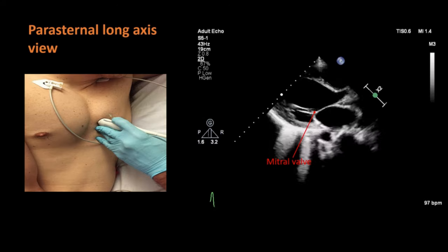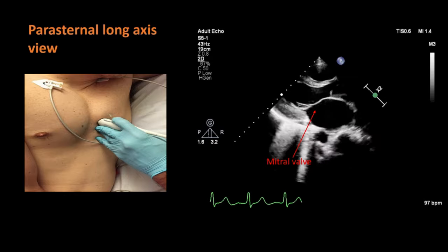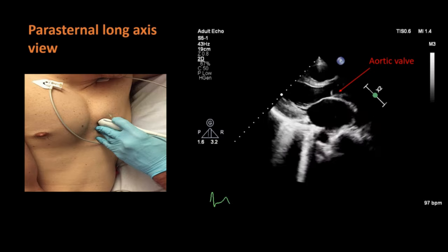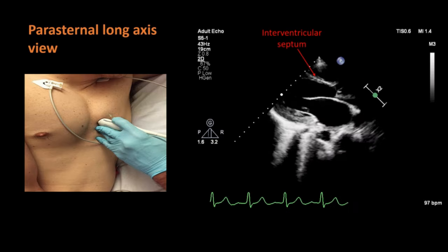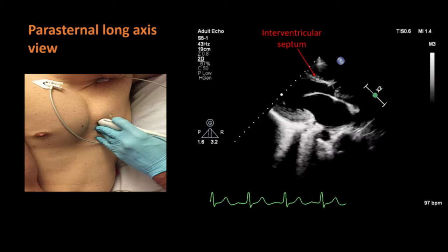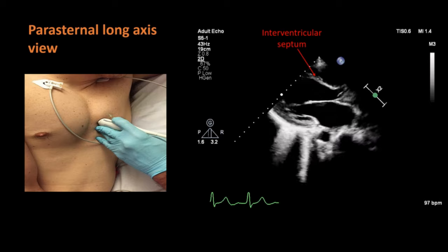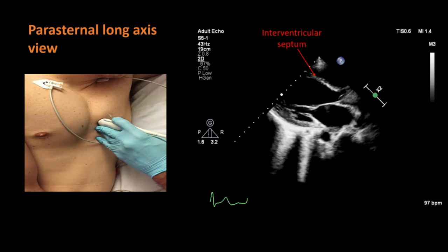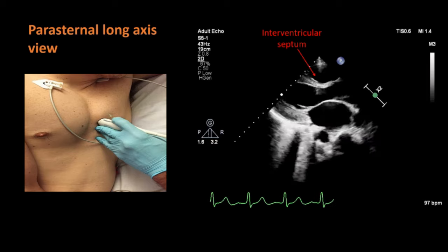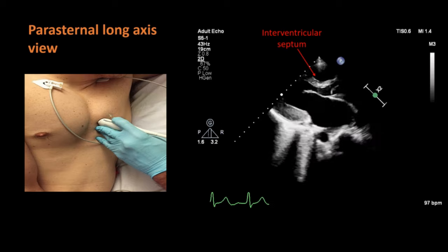This is the mitral valve between the left atrium and left ventricle. We can see the aortic valve and the interventricular septum between the left and right ventricles. In this view we can comment on the size of the left atrium, proximal aorta, and the functions of the mitral and aortic valves. With the help of M-mode, we can also calculate the LV ejection fraction quantitatively in this view.